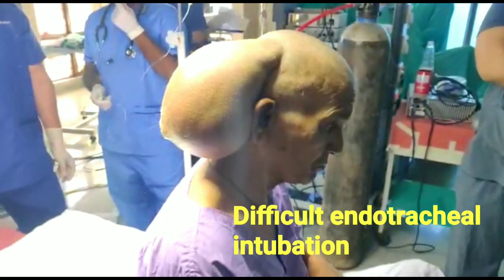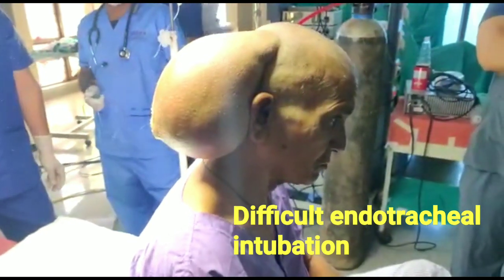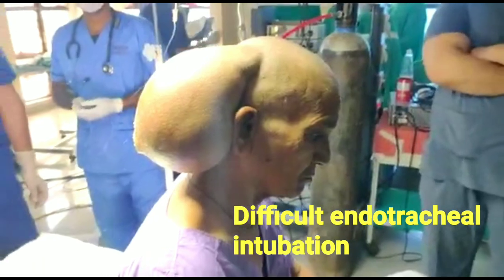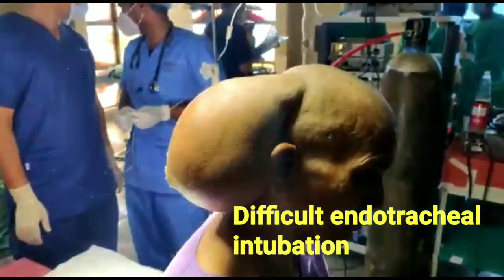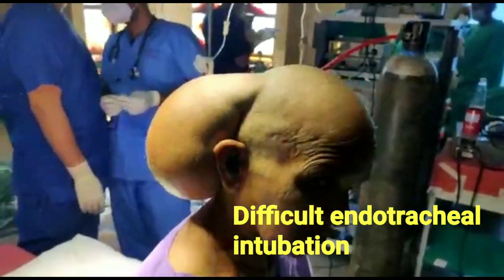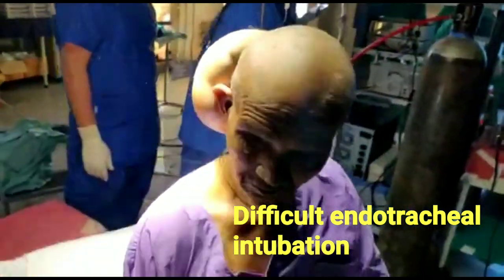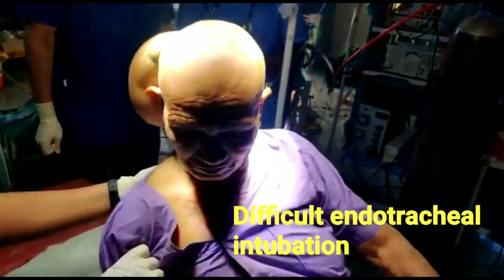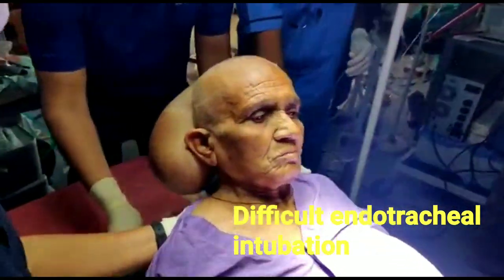Hello everyone, myself Dr. Ektaka Kadia, second year resident from GK General Hospital, Bhuj. I am presenting a case of difficult intubation in a patient posted for excision of large sebaceous cysts on the head under general anesthesia.